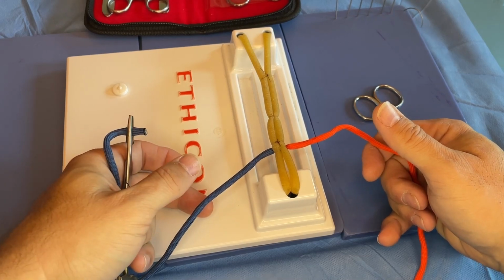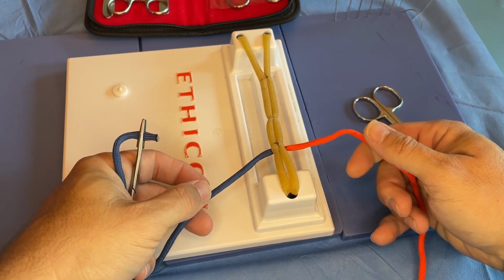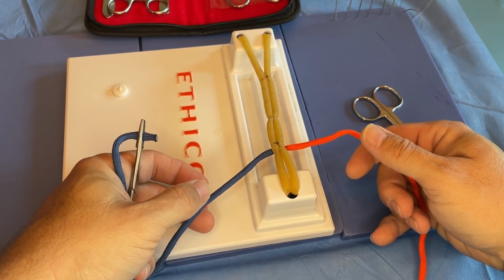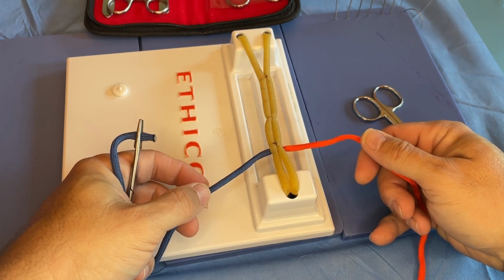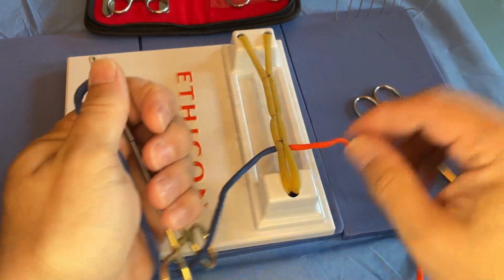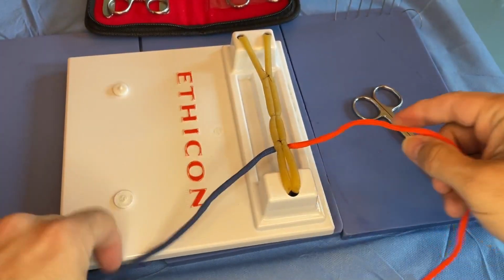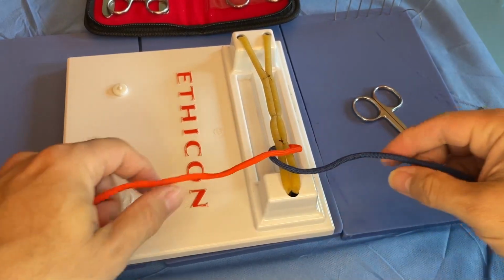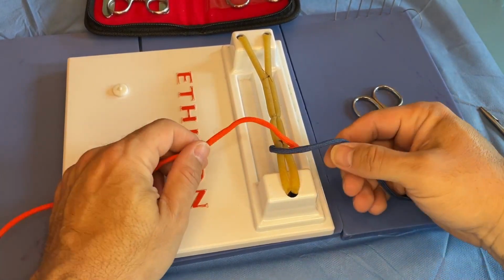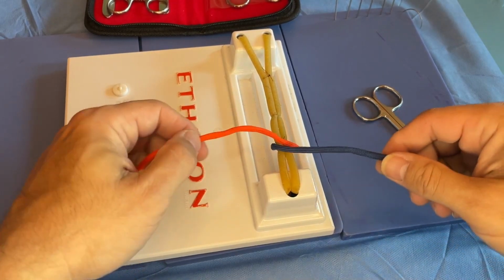Again, you'll see a lot of personal approaches and personal opinions on how to do this, but what matters is the integrity of your knot. As long as you're laying down true square knots and keeping enough tension on the suture that they don't turn into an air knot, you're fine. I know a lot of you have tied knots of different varieties, and maybe you've grown pretty comfortable with the 2-handed and even 1-handed knots. That's fine, just continue to practice that.